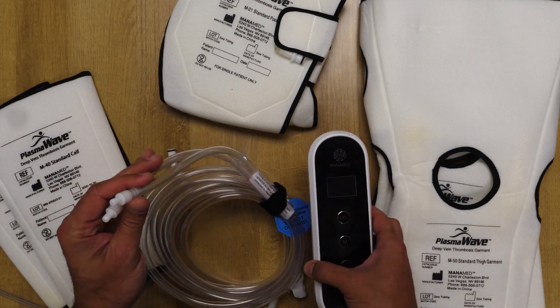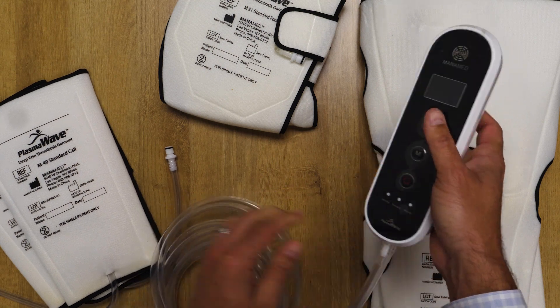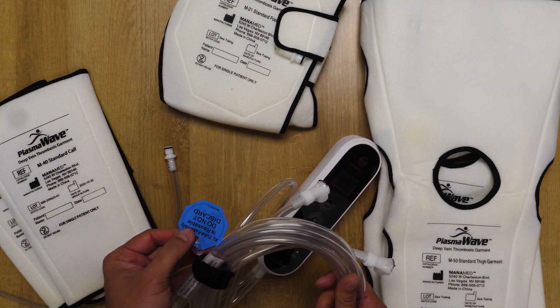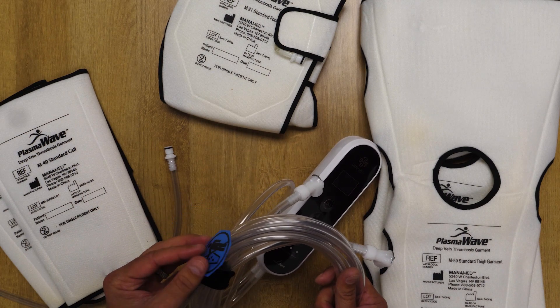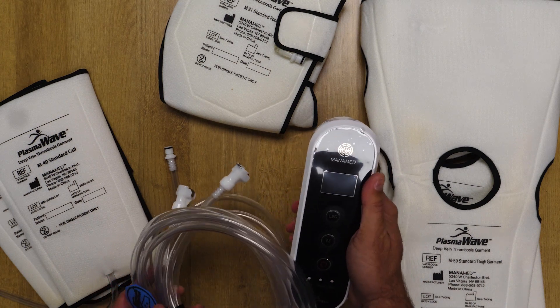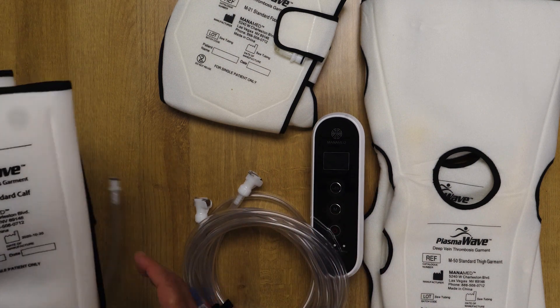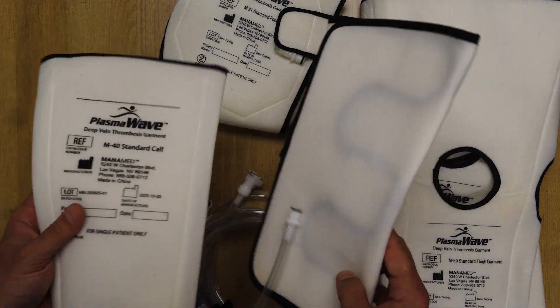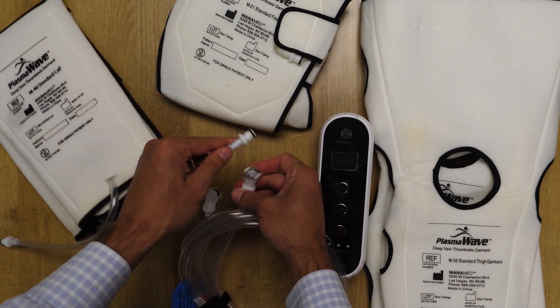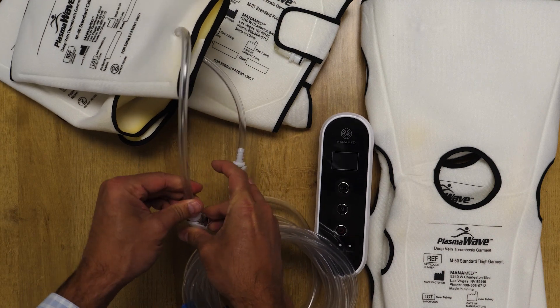In order to use the disposable option, you would insert the tubing — that is reusable. We want to make sure that no one throws this out or discards it between patients. We conveniently place a do-not-discard tag on the device, so remember, this does not get thrown away. To use the disposable calf option, the surgery center or hospital will open a brand new pair of standard size calf sleeves, plug them into the device tubing, and secure until you hear an audible click.